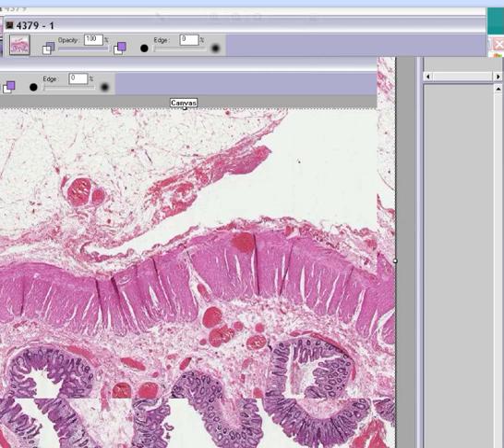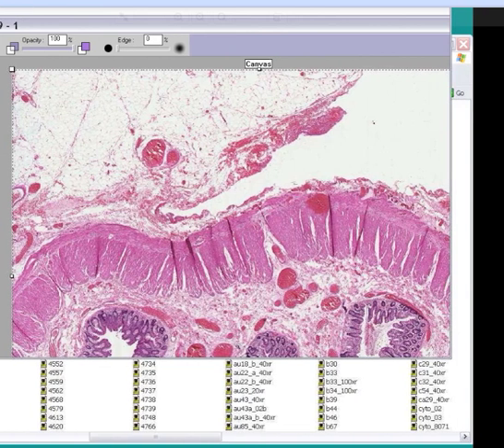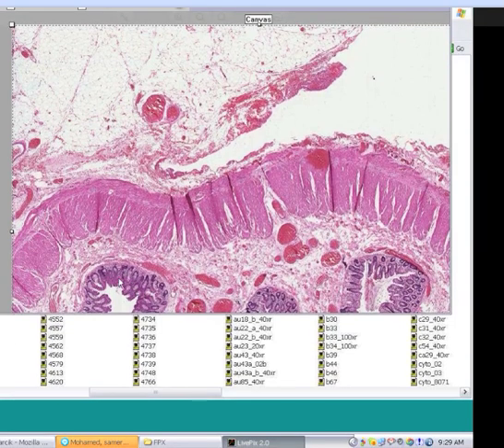Okay, Dolores can see it already. I guess we're getting faster now. So as long as you're there, let me ask you a quick question again. What's the organ? Well, you know it's not a liver. You know it's not an esophagus because it doesn't have squamous mucosa. You know that there's a mucosa over here, a submucosa, this loose vascular connective tissue here, and then a muscularis here.